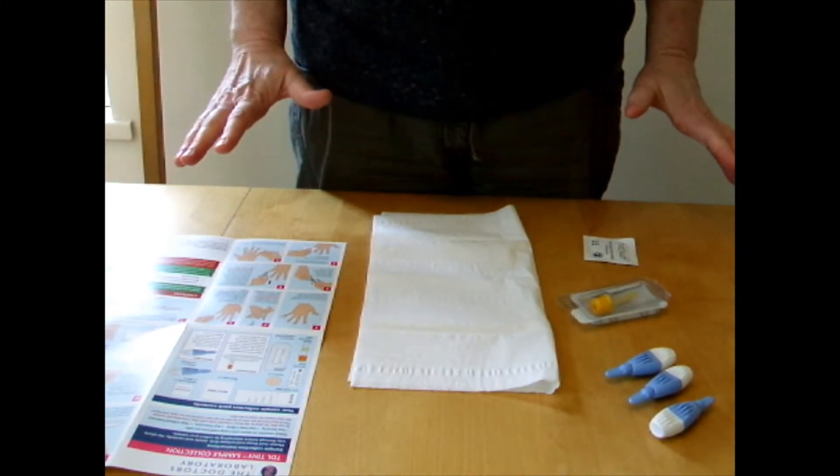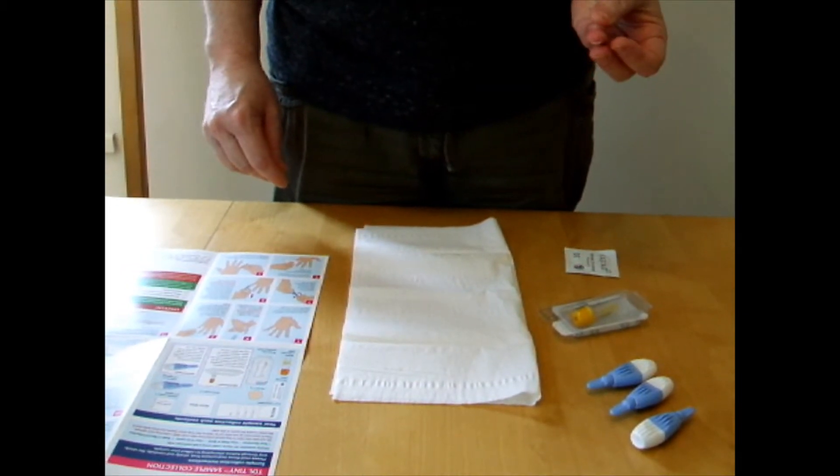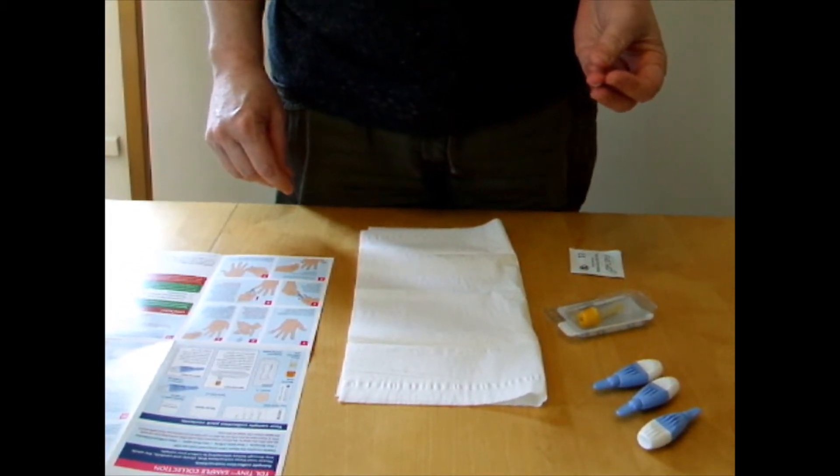This is how to take a blood sample from your finger to test for HIV, syphilis, hepatitis B and hepatitis C.